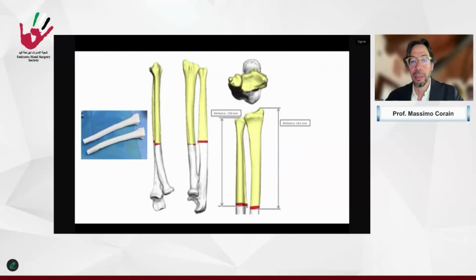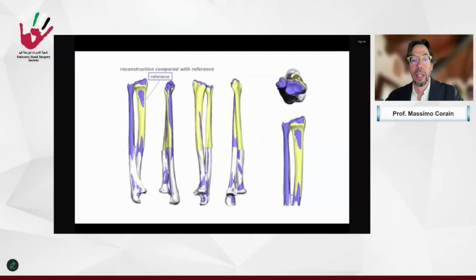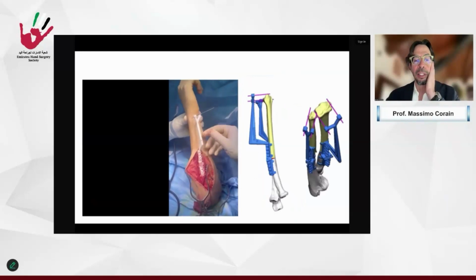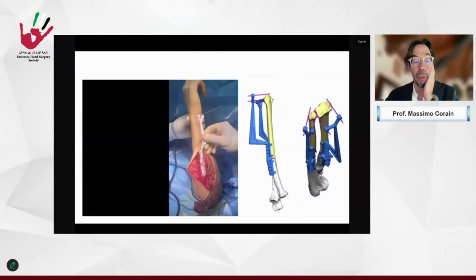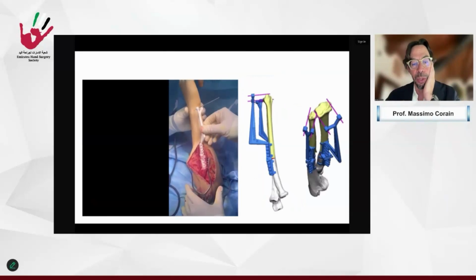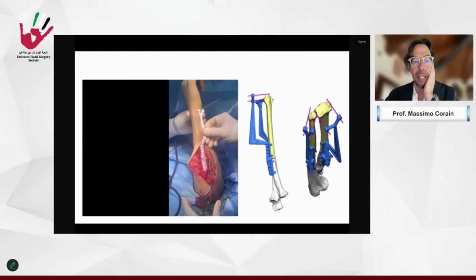So this is the simulation of the double osteotomy of radius and ulna, the perfect size where to do that with the inclination, the simulation, the custom-made plate. This is the reconstruction compared with a reference and some intraoperative steps. This is to show you how the guide is fixed on the ulna, because maybe 1 millimeter of movement or wrong alignment can make a false osteotomy with a problem at the final. So it has to be fixed and very well aligned as planned.